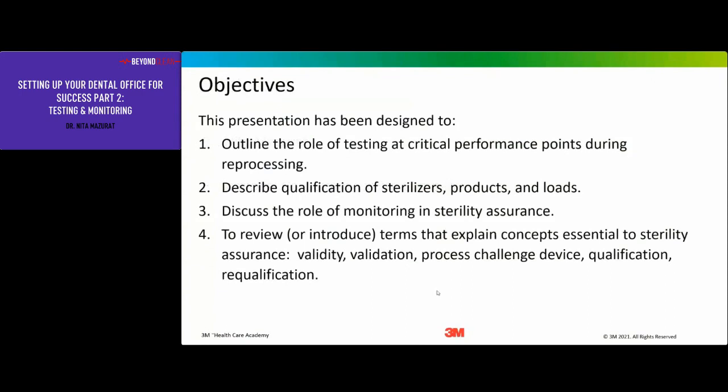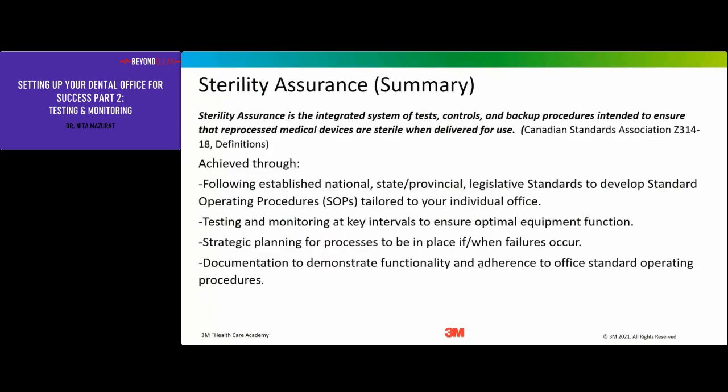This presentation has been designed to outline the role of testing at critical performance points during reprocessing, to describe qualification of sterilizers, products, and loads, to discuss the role of monitoring in sterility assurance, and to review or introduce new terms to dentistry that explain concepts essential to sterility assurance: validity, validation, process challenge device, qualification, requalification, and hopefully even some other terms that I have not included on this list that you can become comfortable with and start using in everyday practice.